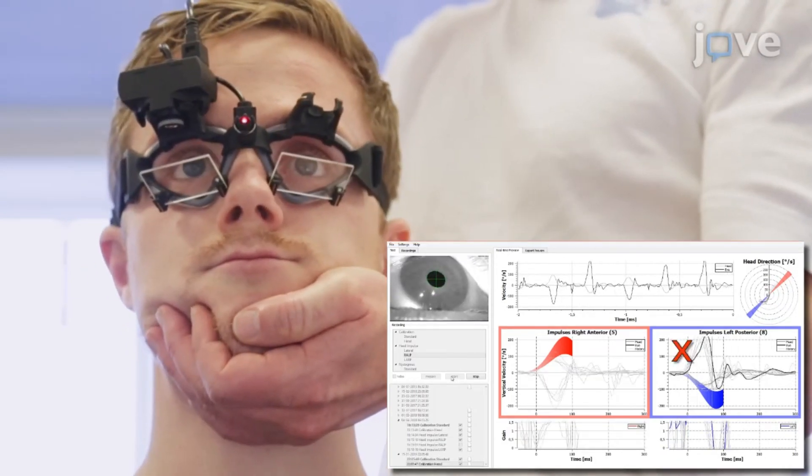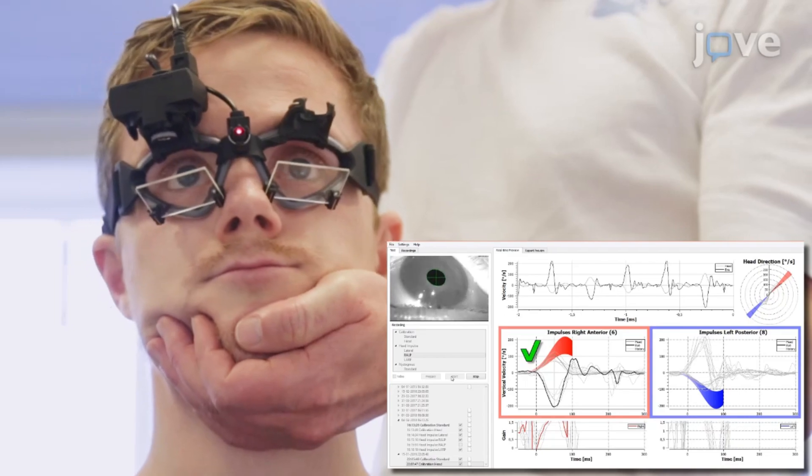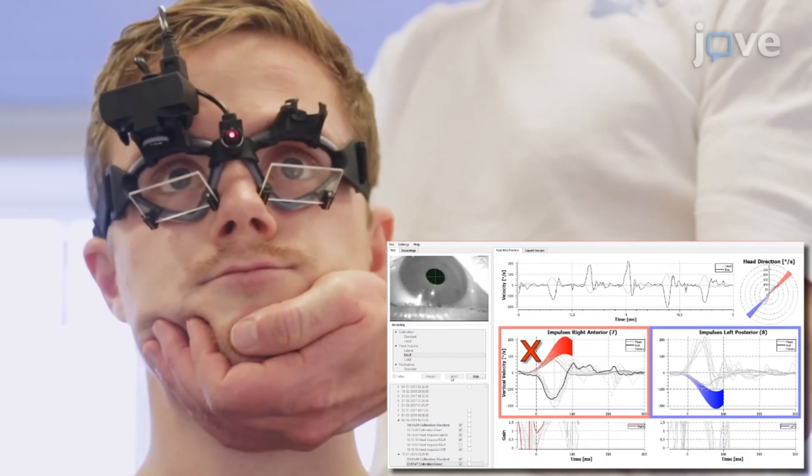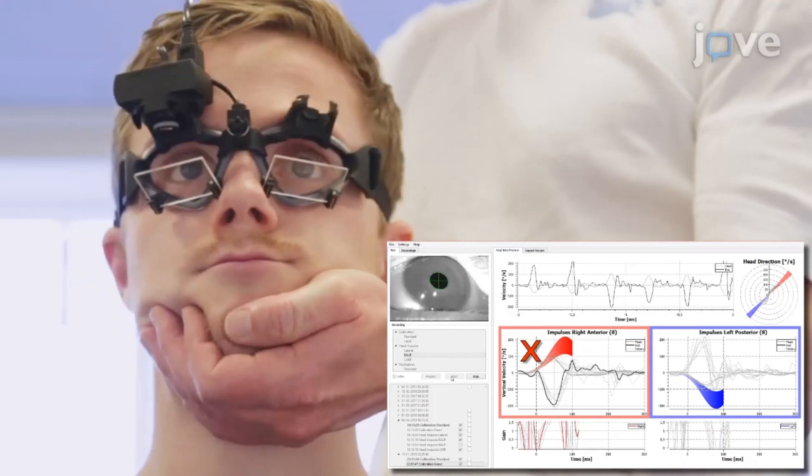Remember, head impulses need to be fast, abrupt, unpredictable, with high acceleration, and with low amplitude. Finally, after completion of the VHIT test, evaluate and interpret the test report.